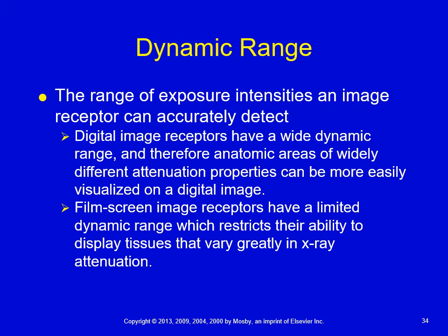Digital also allows you to adjust things like brightness and contrast in post-processing, meaning after you take the image, same as when we edit images of our selfies or our kids, we can change those images after the fact. We can do that in digital imaging, or in X-ray imaging.